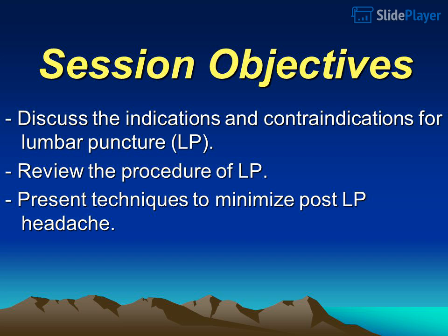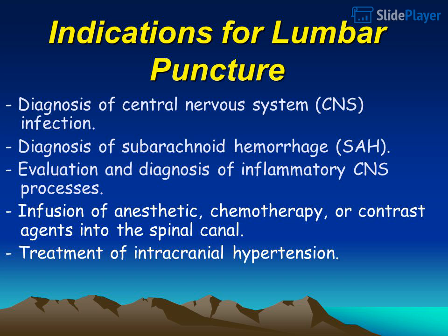Session objectives. Discuss the indications and contraindications for lumbar puncture, LP. Review the procedure of LP. Present techniques to minimize post-LP headache. Indications for lumbar puncture.